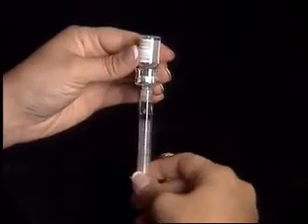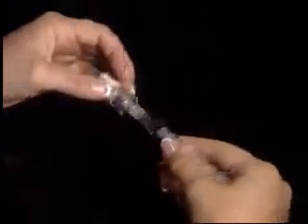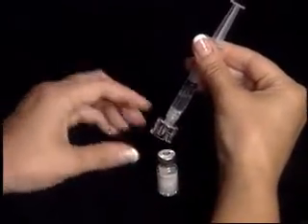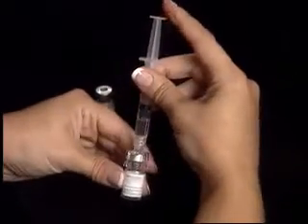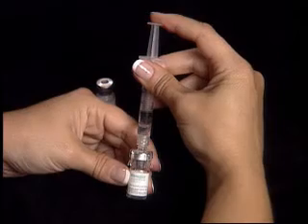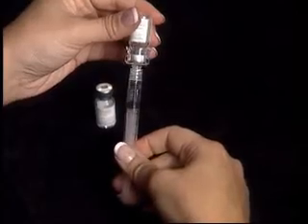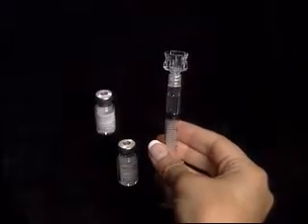Inject the diluent slowly into the vial of powdered medication. Once again, turn the vial upside down and pull back on the syringe plunger to withdraw the newly mixed medication. For demonstration purposes, we are mixing 2 vials. Repeat the process using the newly mixed medication to dilute the next vial of powdered medication. This will increase the dosage without increasing the liquid volume.